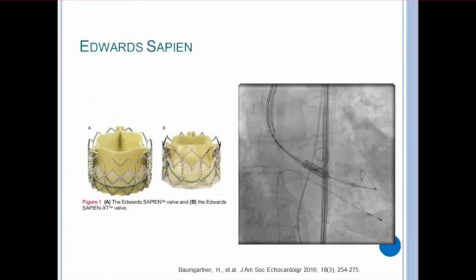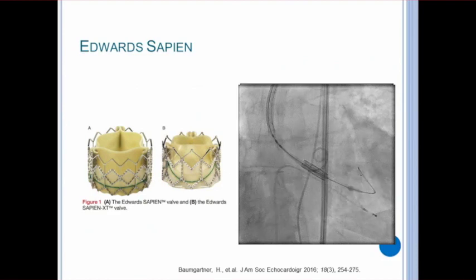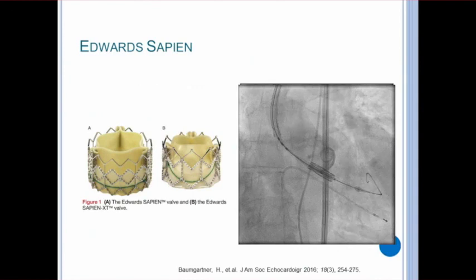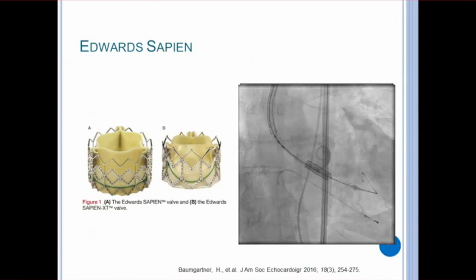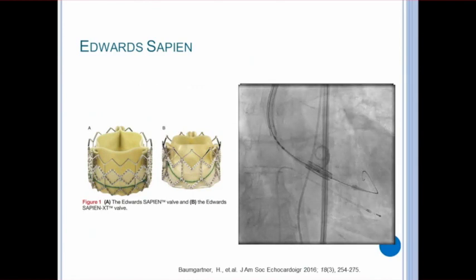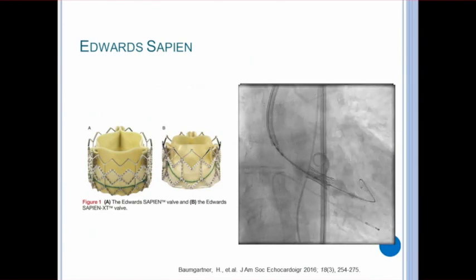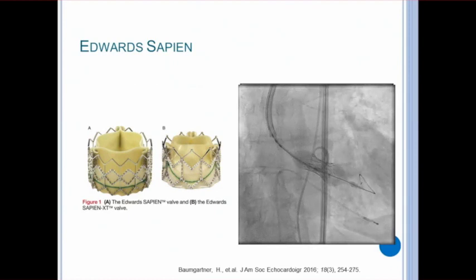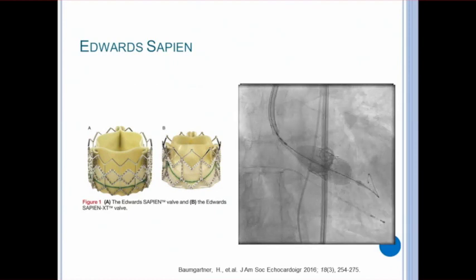Let's move on to the TAVR procedure. As I mentioned in the trials, there are two valves that are used today. Here is the Edwards Sapien valve, a balloon expandable valve that cannot be adjusted once placed. On the right is a cineangiogram of the valve deployment. You can see the balloon expand inside the valve, and the valve cage expands until it is anchored into the aortic annulus.